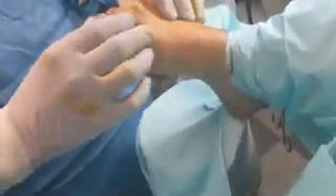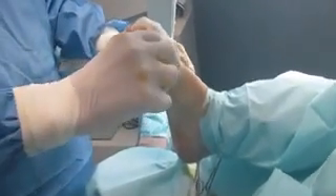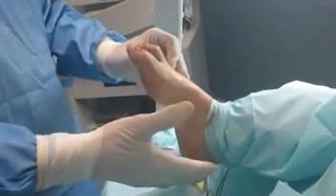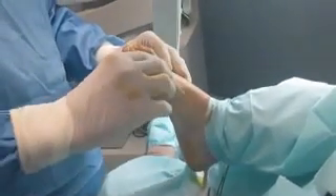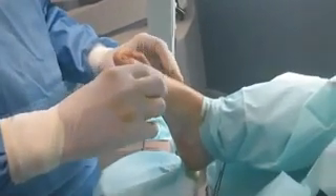Some patients, you can just get by with just doing a decompression. For those patients, you first look at their foot type. You can see this patient has a rigid rear foot when in neutral position here, and her sagittal plane level of her first ray is equal. So she has a rigid rear foot and a flexible forefoot, but she doesn't have a hypermobile first ray in any way.